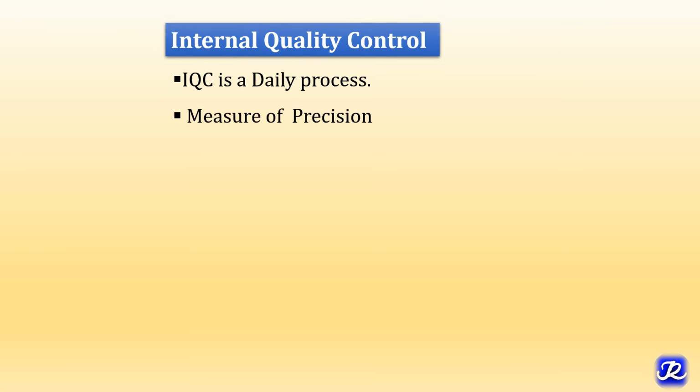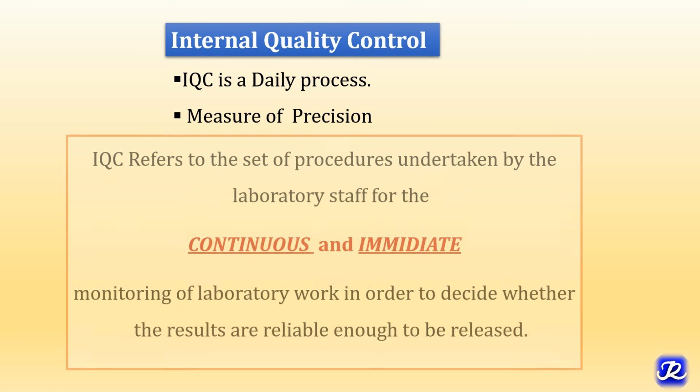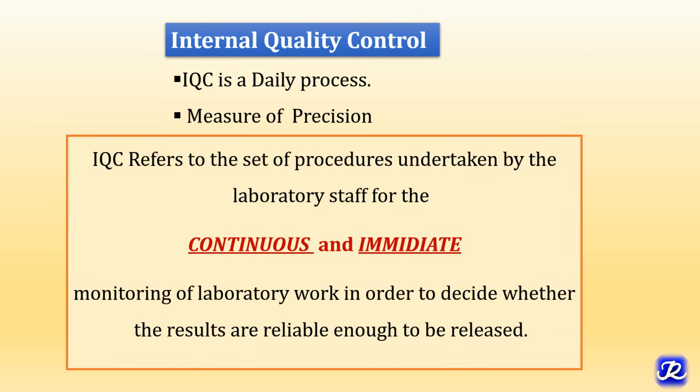So internal quality control is a measure of precision, and by definition, IQC refers to the set of procedures undertaken by the laboratory staff for the continuous and immediate monitoring of laboratory work in order to decide whether the results are reliable enough to be released or not.